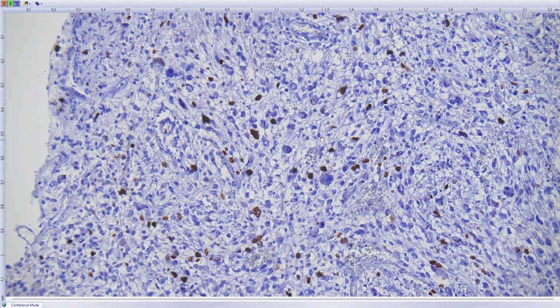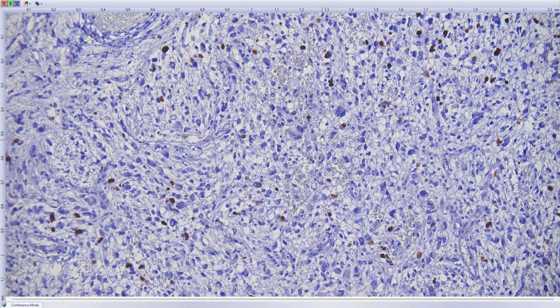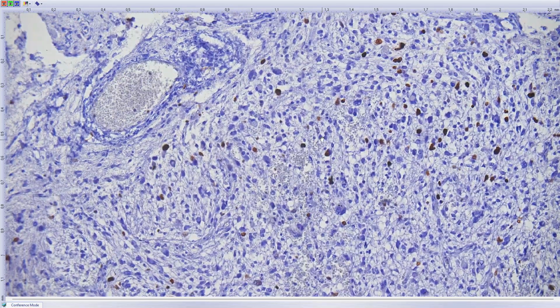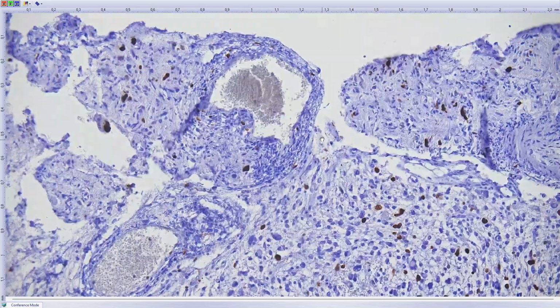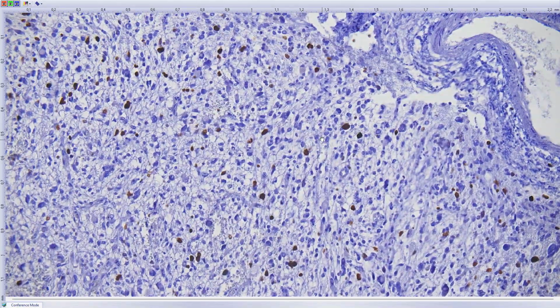The tumor affects mostly the pediatric population and then stops growing, but very rare examples may recur or progress and develop anaplastic features and may even kill the patient. So probably this is one candidate which will behave much more aggressively. And that's it from my side.